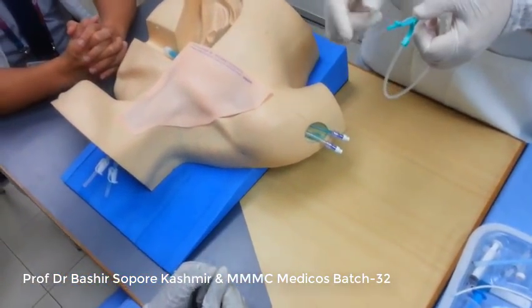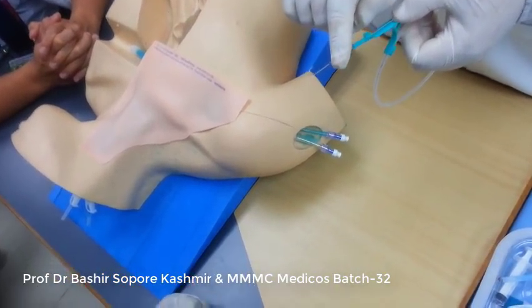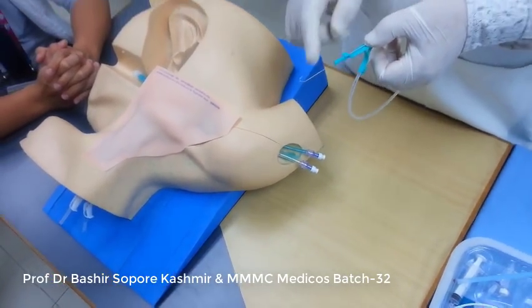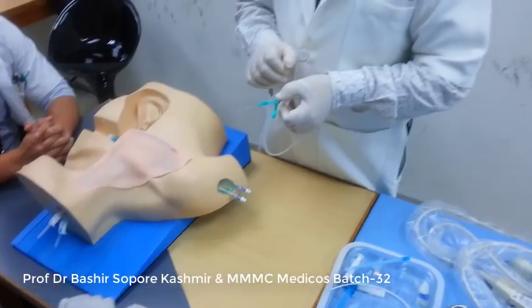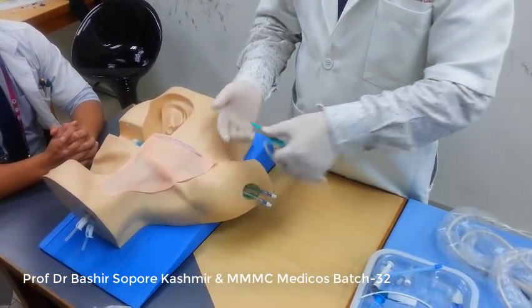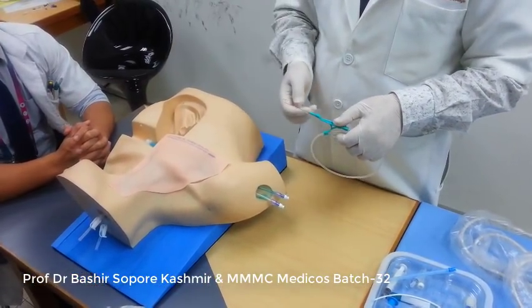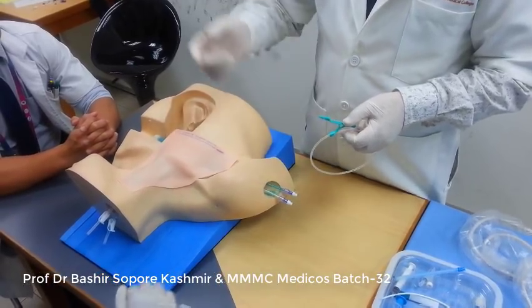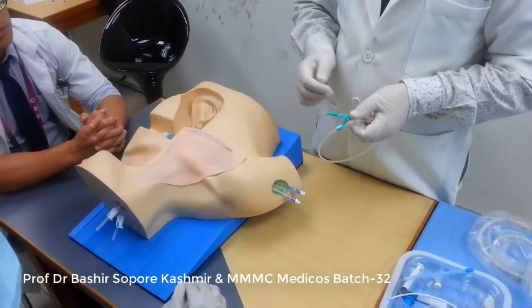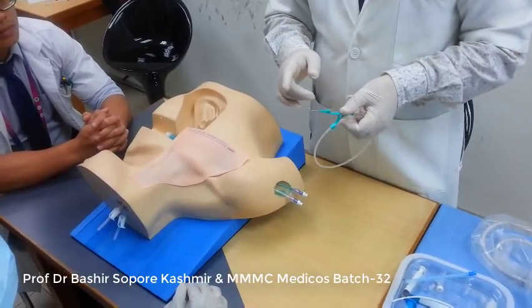Why is it J-shaped? Because it has a J-shaped bend or kink here at the tip. Why does it have to be J-shaped? Because when it glides over the vessel like this, you understand my point? It won't penetrate the vessel. It will slide or glide over the vessel wall. So there will be less chance of perforation of the vessel. That is why it has to be J-shaped. So when you are doctors tomorrow, don't try to cut it and make it straight. You understand my point? Because you already know.